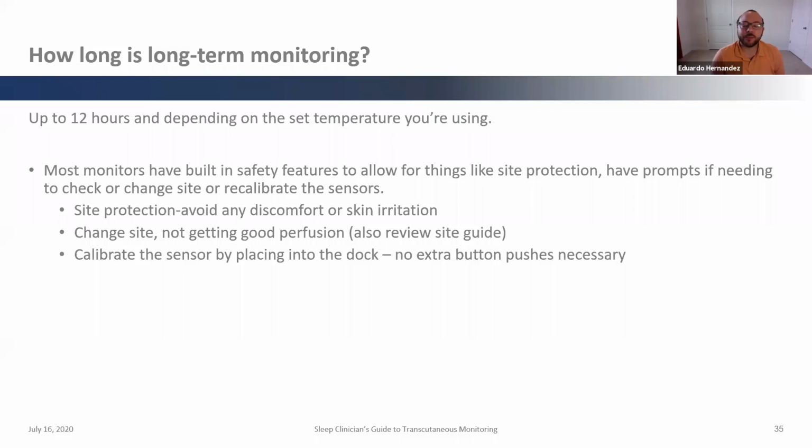I had mentioned before that long-term monitoring is long-term, and I just wanted to review up to 12 hours. That's really important to know, because the average sleep study in the adult world is about 6 hours, in the pediatric world about 7. So you can have almost a confidence that your transcutaneous monitoring is going to last the time before and after, lights out, lights on, that kind of thing. It really gives you confidence if you're diagnosing hypoventilation or CO2 values, knowing that these are built for monitoring up to 12 hours.